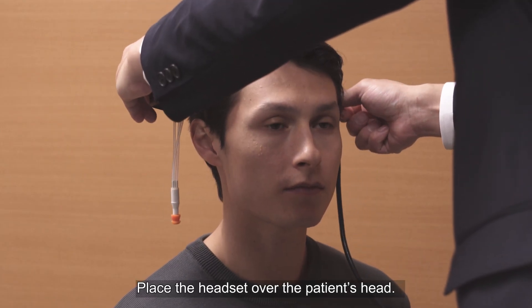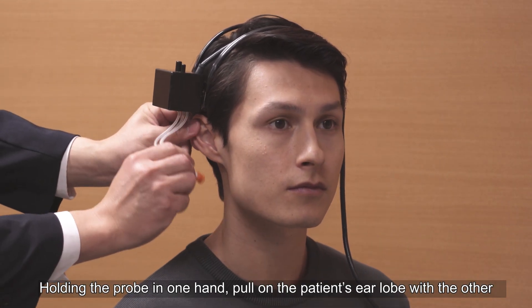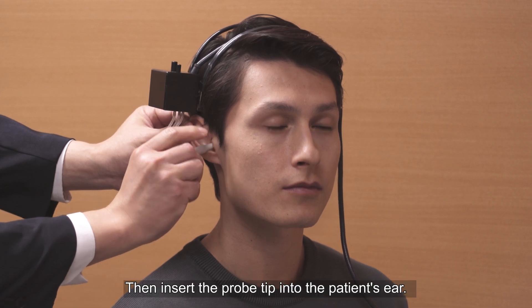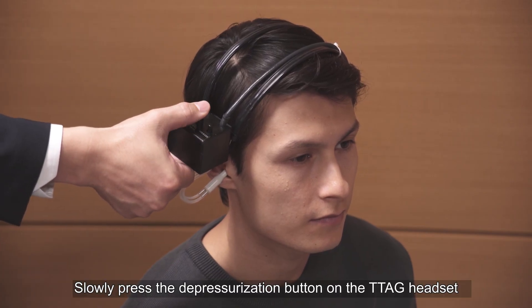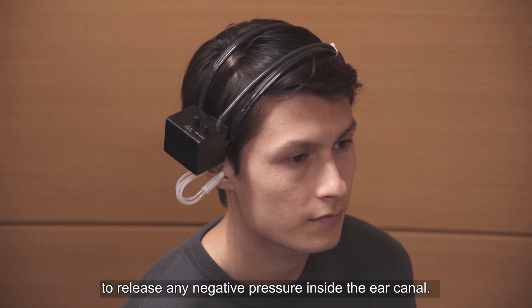Place the headset over the patient's head. Holding the probe in one hand, pull on the patient's earlobe with the other to widen their external ear canal. Then insert the probe tip into the patient's ear.